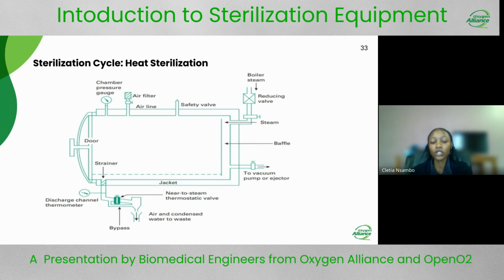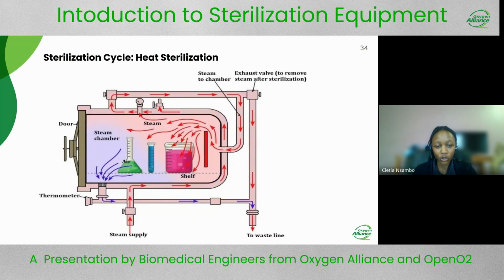the sterilization process will take 15 to 60 minutes depending on the temperature. So after you let the steam in the chamber and the sterilization process is complete, you now dry or cool down your items. So this is just a pictorial view to visualize the movement of the phases. We'll just use another picture for a better view.